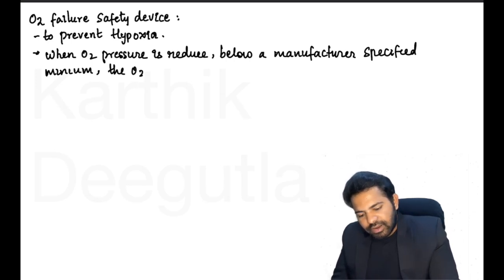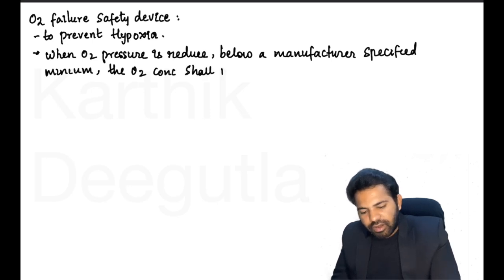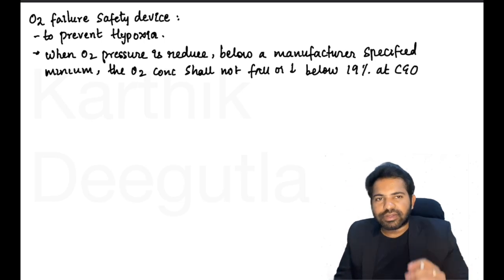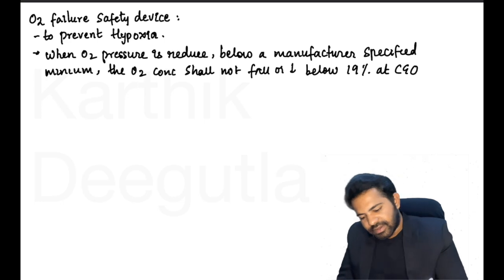The oxygen concentration shall not decrease below 19% at the common gas outlet. This is known as oxygen failure safety device.